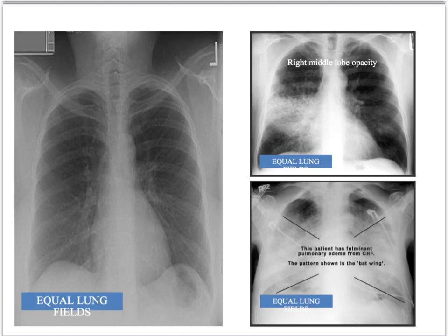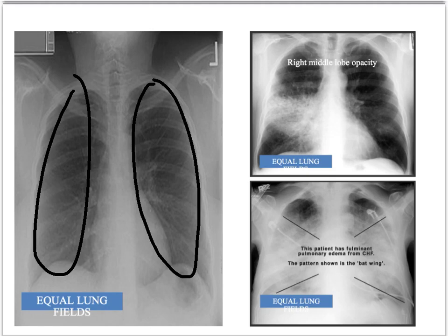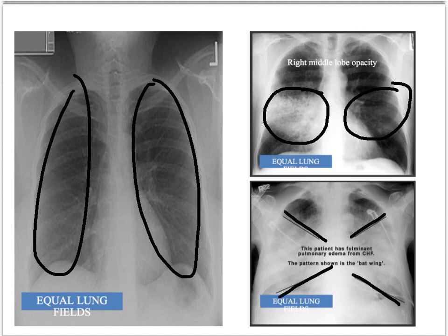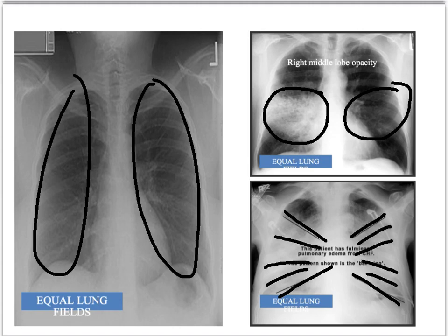After the diaphragm, we look at the lung fields — E for equal lung fields. You are simply comparing both sides. Normally you see lovely lung markings on both sides that look equal. In this example, there is an obvious opacity on one side looking very different from the other. This is a clear example of the bat-wing or butterfly appearance of pulmonary oedema — a diffuse, fluffy effect on both sides. Be careful, as pulmonary oedema is not always this obvious, but with the right clinical signs this X-ray should confirm your diagnosis.